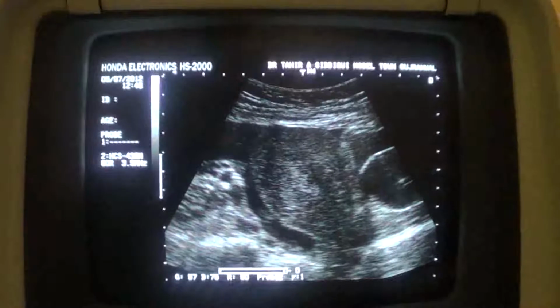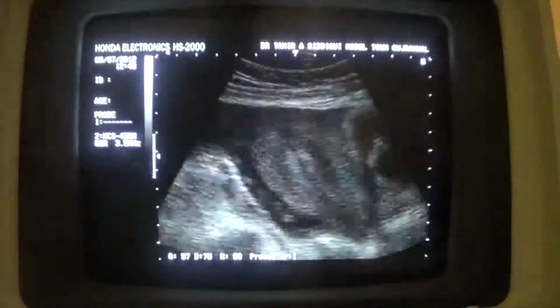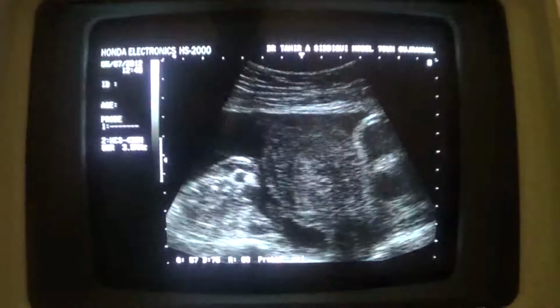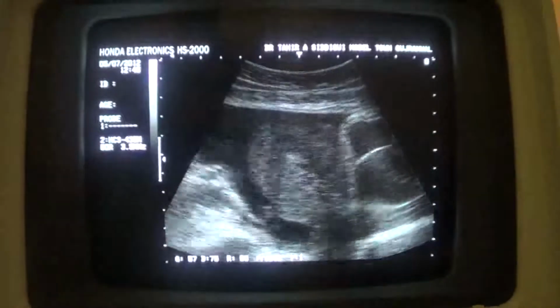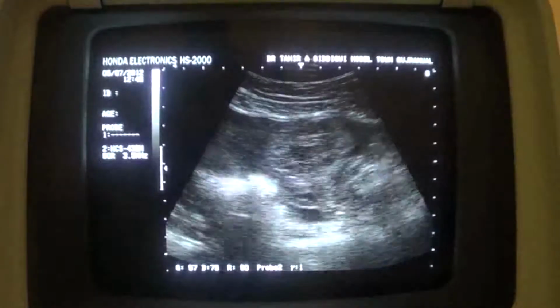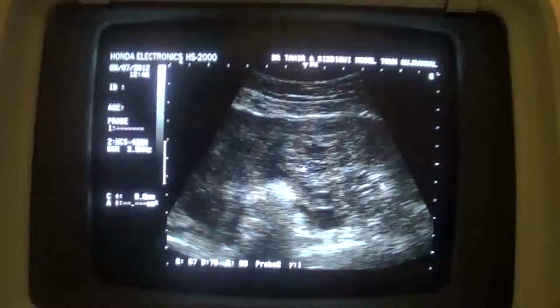You see, this is the posterior wall and anterior wall. There does not seem to be any breach within the myometrium, in longitudinal or transverse section. So this is a ruptured ectopic pregnancy with collection of blood transforming into a clot in this area.